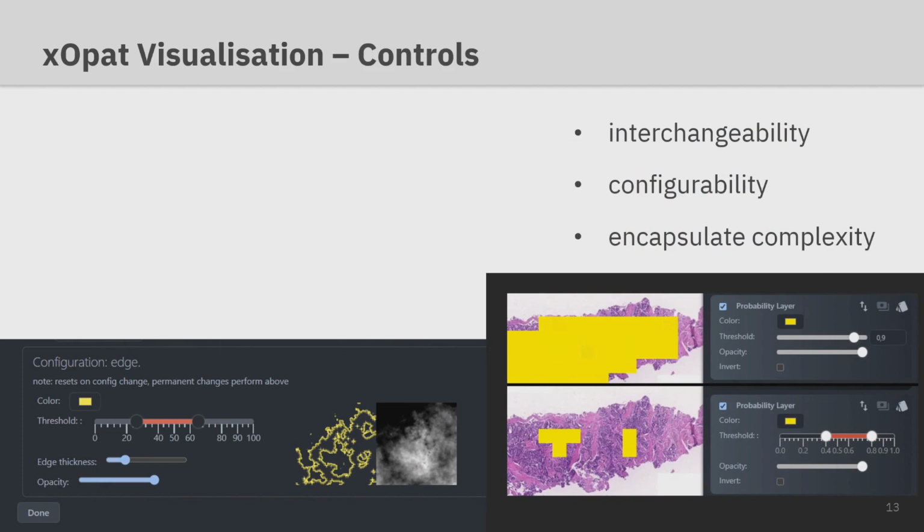One of the powers of this platform is the abstraction from user input. Each shader specifies constraints on variables on which compatible input controls are interchangeable. For heat maps or edge detectors, we can threshold with a single or multi-range slider, allowing us to perform different visualization tasks. Another example might be turning the opacity heat map, which is by default based on a solid color input, to an opacity color map based on color map input, all without explicit programming.